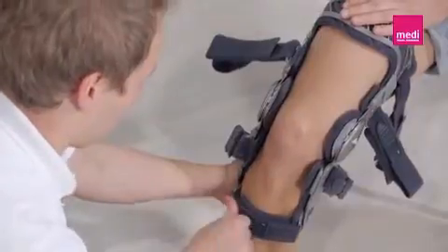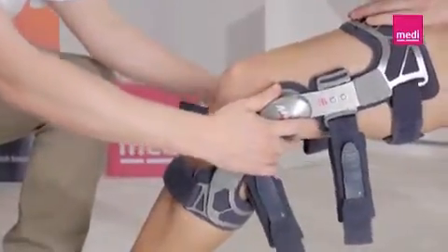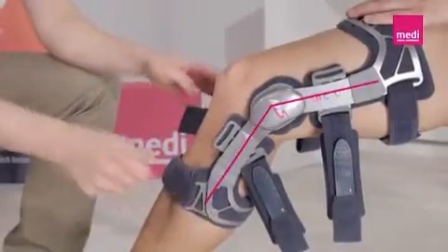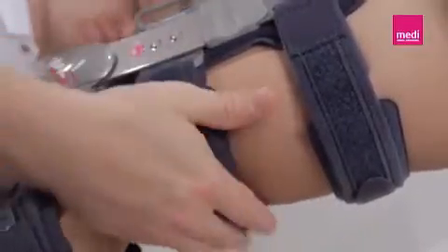Start with straps 1 and 2. The knee should stay bent. Now push both orthosis hinges backwards towards the back of the leg. Make sure that the hinges are positioned behind the lateral medial midline of the leg. Now fasten straps 3, 4, 5, and 6.